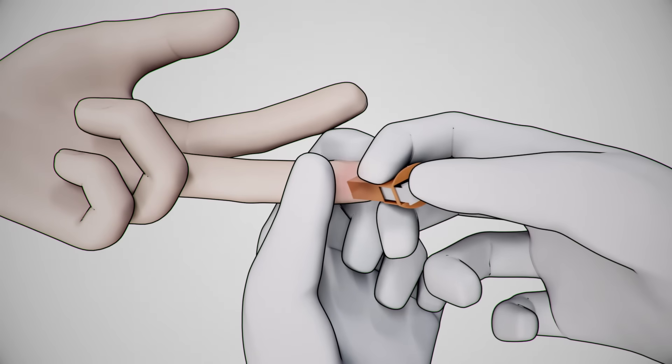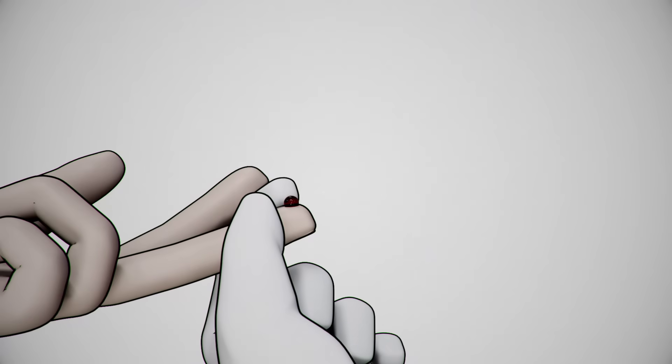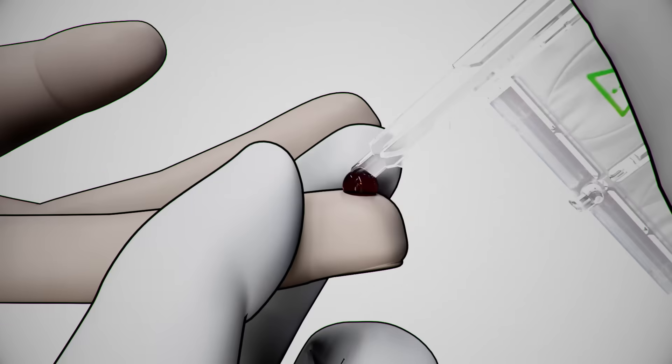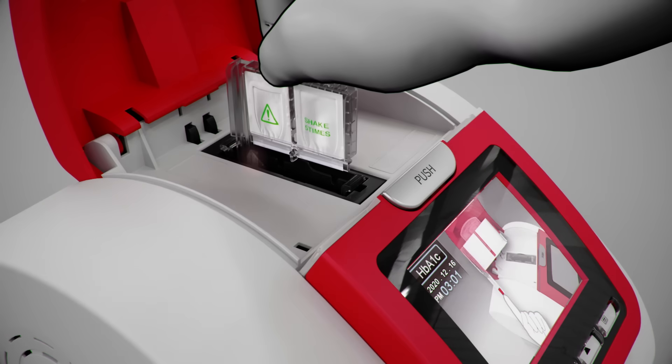Collect a blood sample. Gently touch the blood sample with the tip of the sampling area. The blood is automatically drawn into the sampling area. Hold the reagent pack at a 45 degree angle. Ensure that the sampling area is completely filled. Insert the reagent pack in the cartridge and gently push into the cartridge compartment.